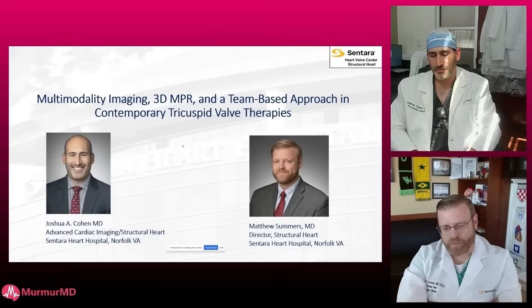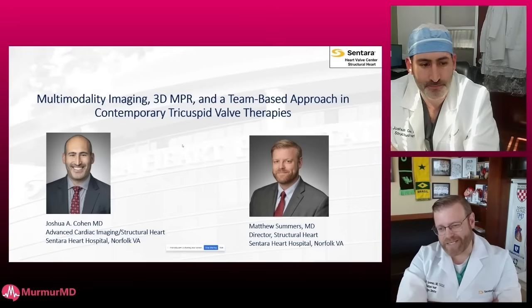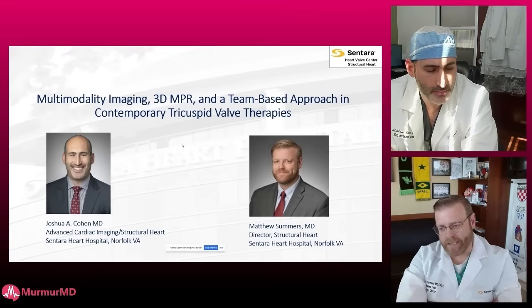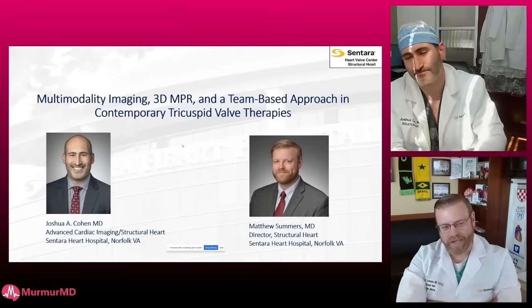And in this platform, the previous focus or emphasis has been on aortic valve disease from a structural heart standpoint. But one thing we're increasingly having more and more discussions, decision points and collaborative discussions about is the complexity of the tricuspid valve, and TR in particular, which we now have repair and replacement options for. And so it's my privilege to introduce my incredible colleague, Dr. Cohen. Dr. Cohen, welcome.